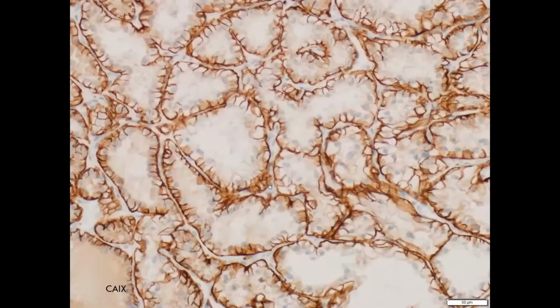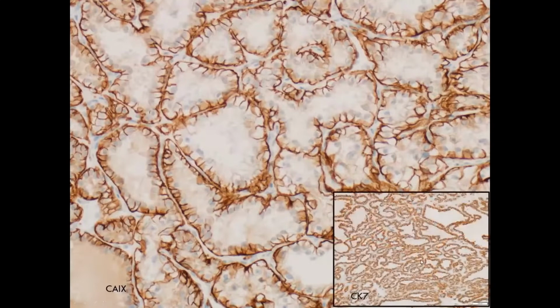So let me illustrate with an example. So here is CA9 in a clear cell papillary renal cell carcinoma. And obviously, you can see that there is a diffuse and strong positivity in all the tumor cells, right? But the pattern of staining is very peculiar. You can see there is a lateral and basal staining, but no staining in the luminal aspect. So this is the so-called cup-like pattern of staining, which is different from the transmembranous or box-like staining that you get in a conventional clear cell renal carcinoma. So this pattern is helpful in making the diagnosis. And also, unlike a clear cell, it's going to be diffusely positive for CK7.